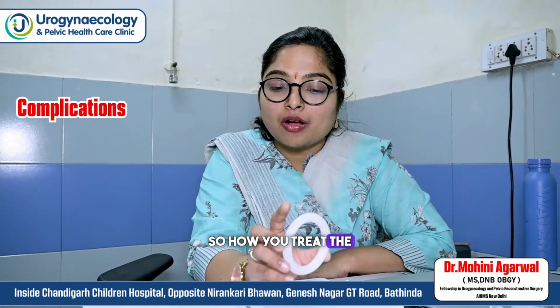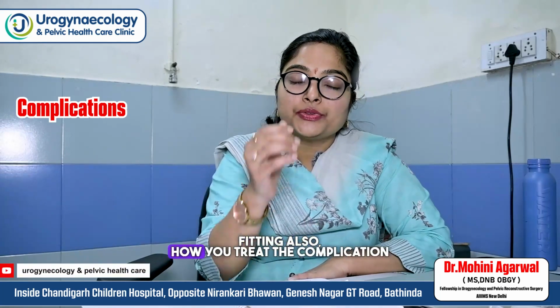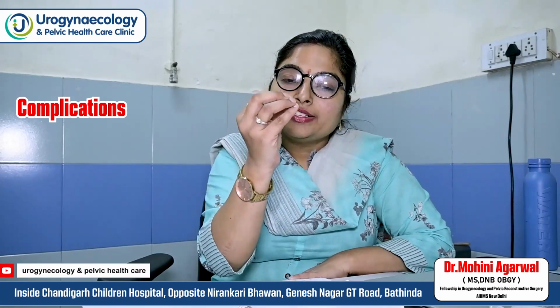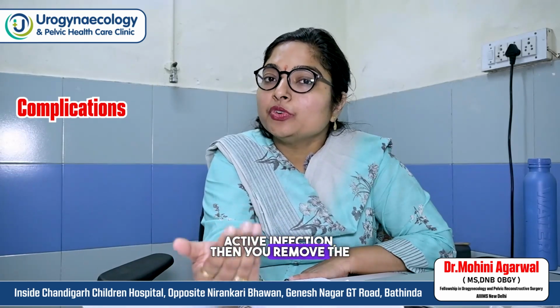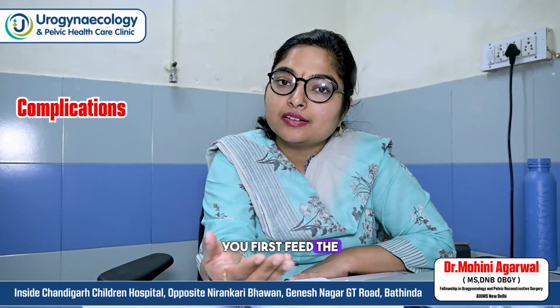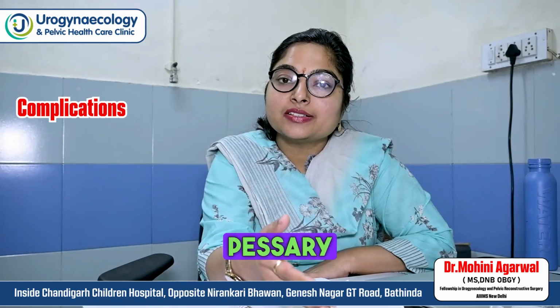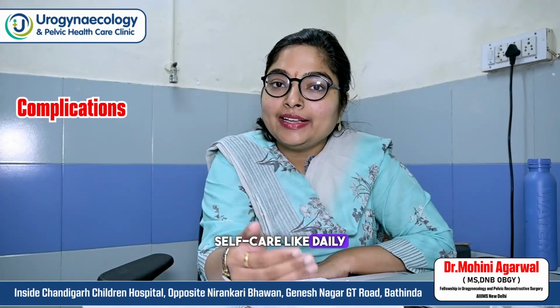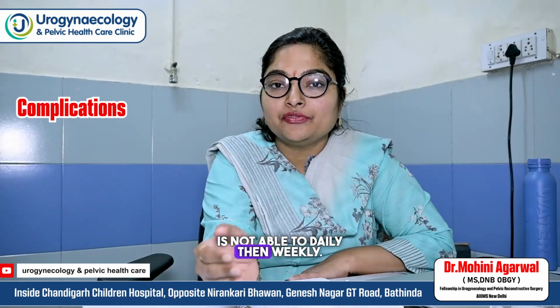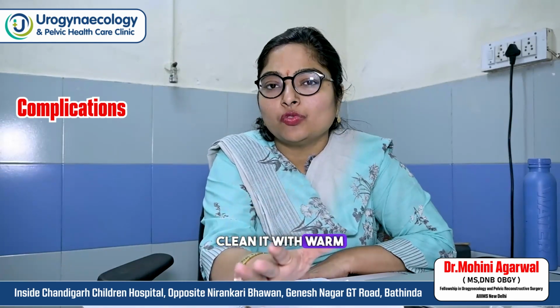So how you treat the complication, as we have seen in the unsuccessful fitting also: discharge is normal, but if it is obviously foul smelling with active infection, then you remove the pessary, first treat the discharge, then reinsert the pessary. After insertion, you ask her to self-care daily, and if she is not able to do it daily, then weekly. Still, if she is having discharge, she can clean it with some warm water.